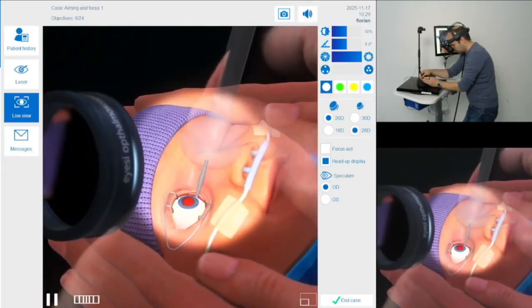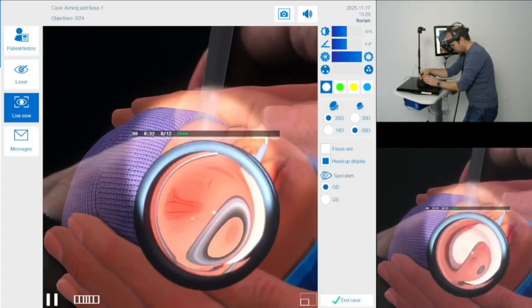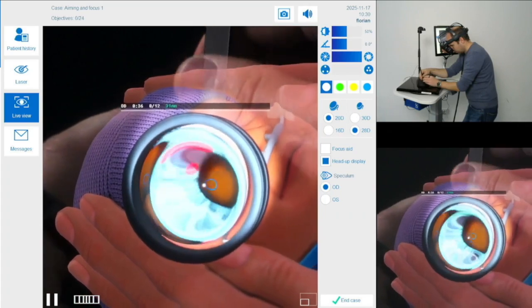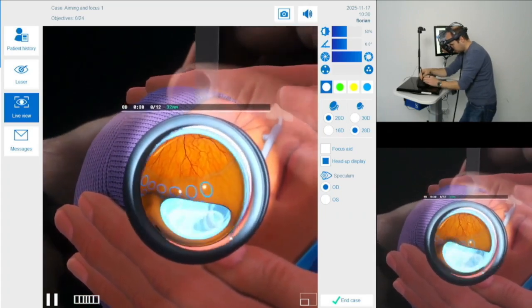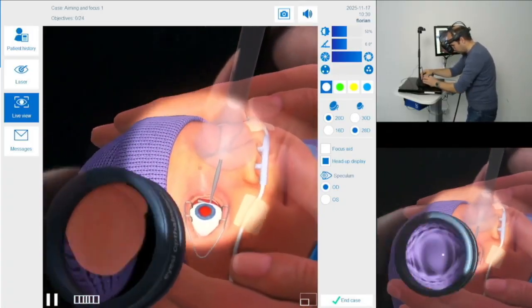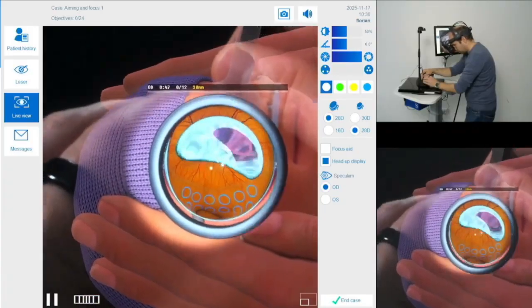I use the indenter to rotate the eye a little bit to stabilize the eye. You see here I have too much indentation. I need to be a little bit more gentle here. And I try to visualize the area. Yeah, that is looking better.